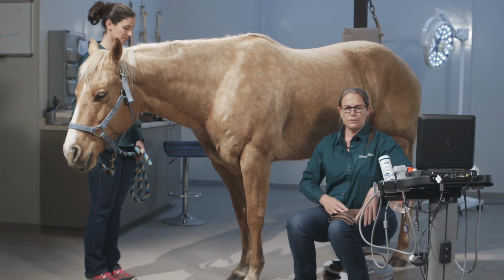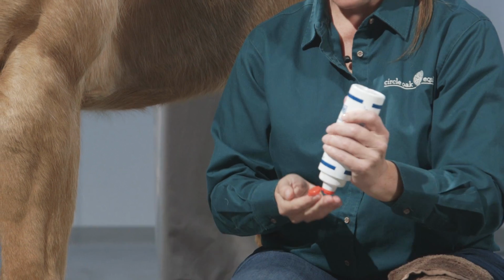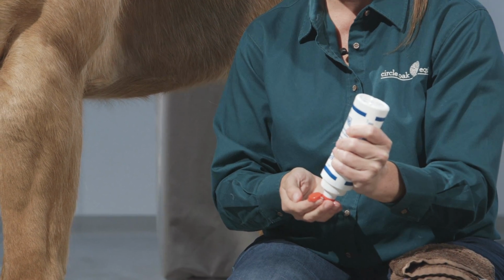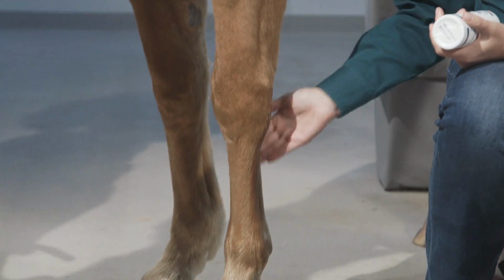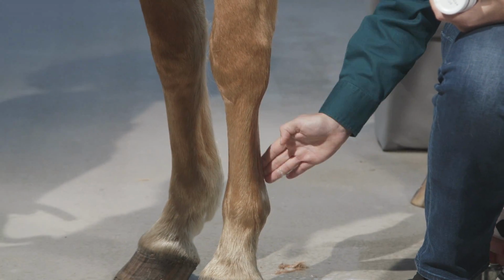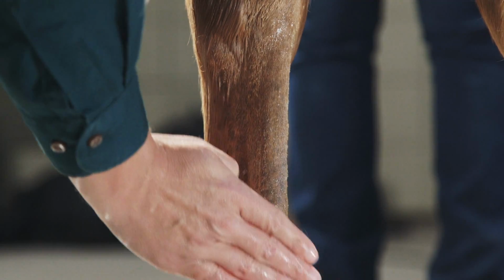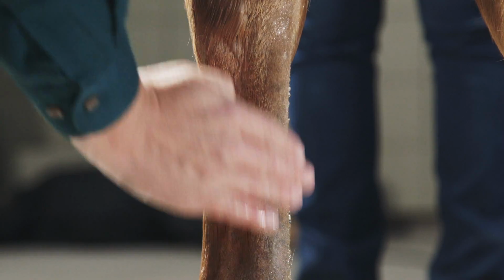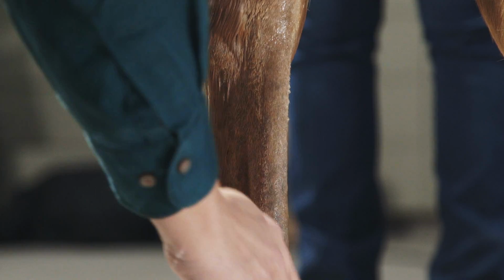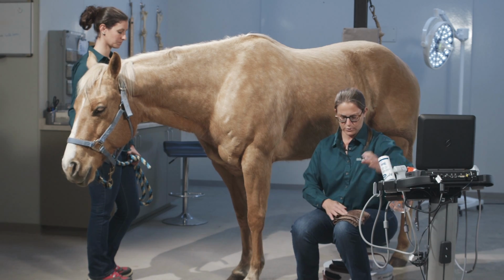And then I'm going to use the same method that I used when I had hair on the leg. I'm going to put gel on against the grain of the hair. And that's going to help fill in all of the gaps in between the hair and the skin. So I'll put the gel on going against the grain, and then going with the grain, and then going against the grain, until it fills in the whole area and becomes a nice film of gel over the surface of the skin.